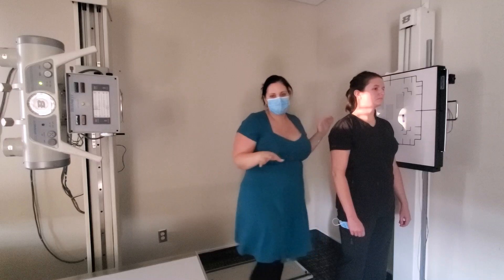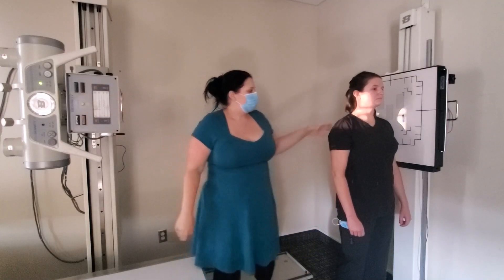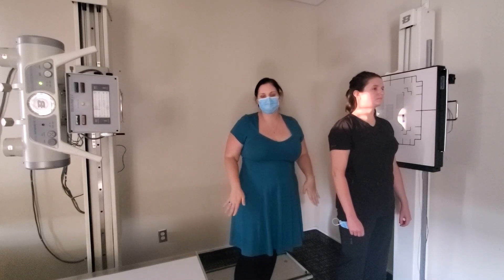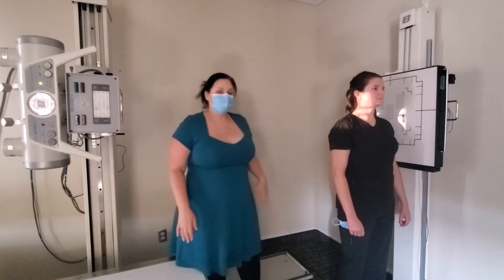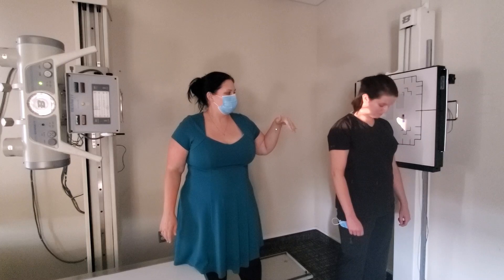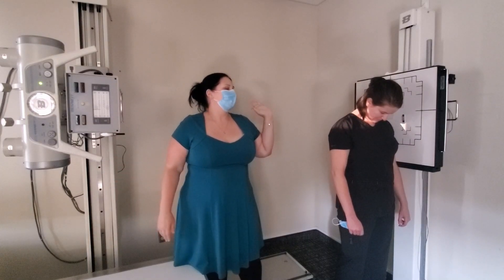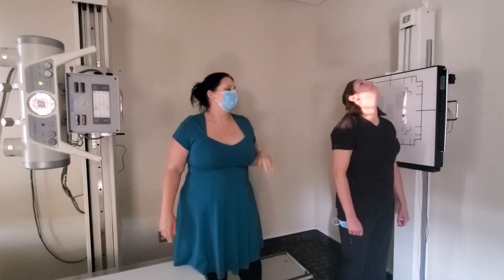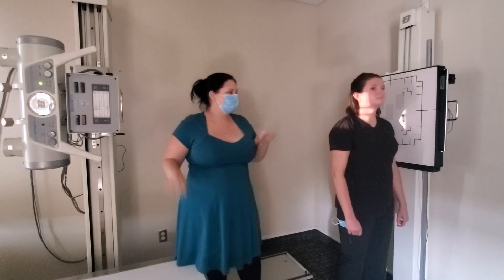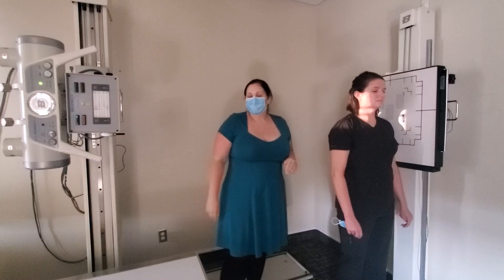Centering is still at C4 — everything except the dens projections centers at C4. That is your lateral C-spine, using deep expiration and hold for this image. The other two projections are the lateral flexion — bend your head down for full flexion — and lateral extension — tilt all the way back. At 72 inches, perpendicular beam to C4, all three lateral options are available for your proficiency.